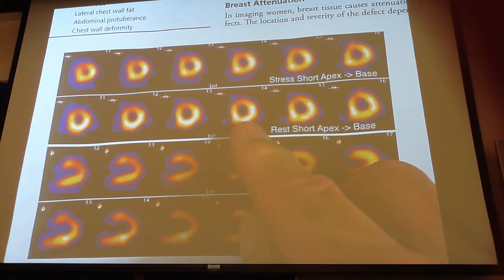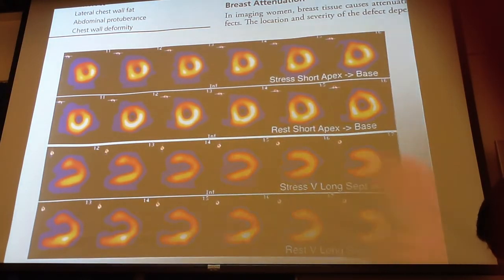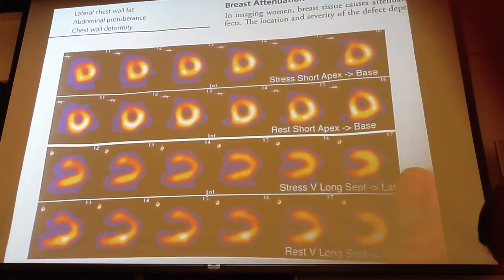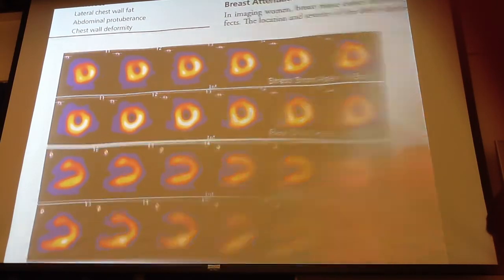Now remember, there's also what they call stunned myocardium. When the heart has been injured, sometimes it's kind of in a hibernating phase until it starts slowly recovering. A lot of times that's when they use thallium, because they can do delayed imaging on the thallium, and it'll start picking up the stuff.